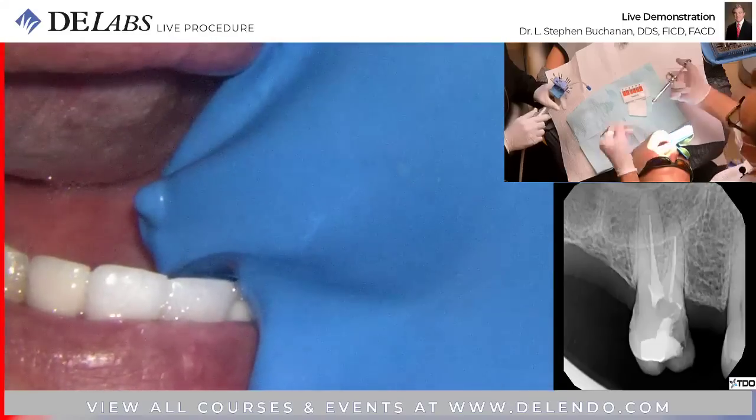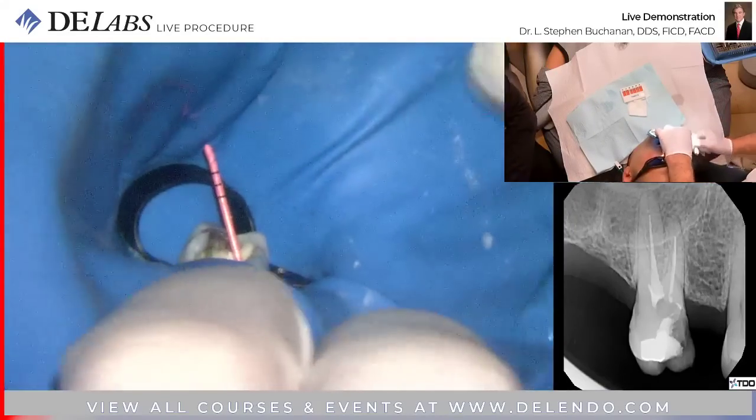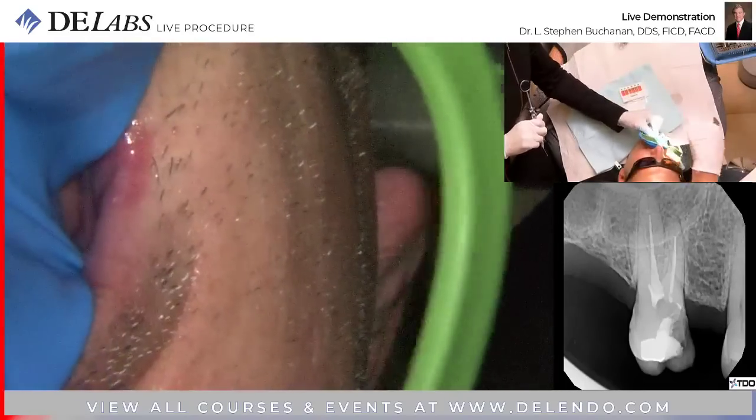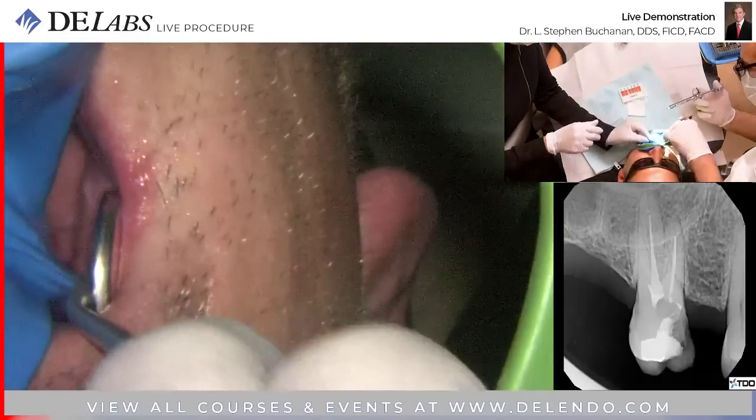And what are you using? This is 1 to 50,000 lidocaine. I use articaine for buccal infiltrations. Close down for me.